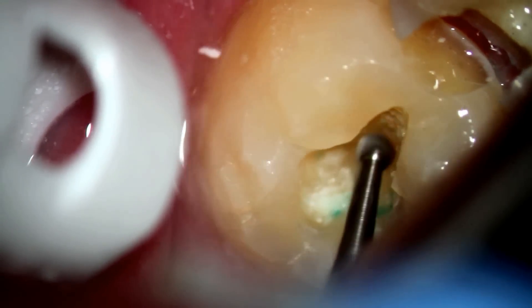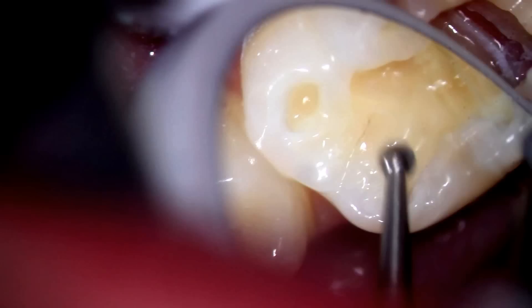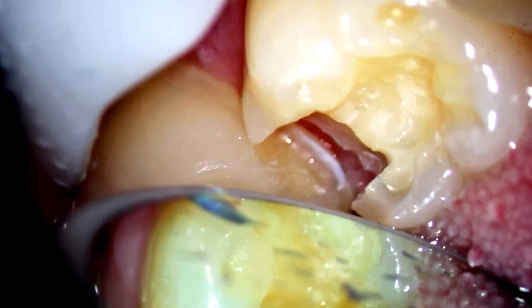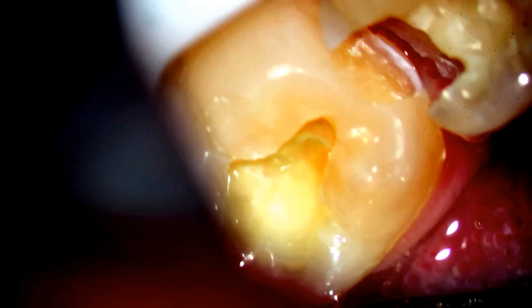You can also see in this view the cavity preparation on the mesial. Now we're switching over to the first molar, making sure everything's taken care of. Notice how I'm using a mirror to see into the tooth and drilling at the same time — so it's not direct vision. Sometimes dentists will remove the decay only from the one view and not use a mirror, and that makes it more difficult to get all the decay out.